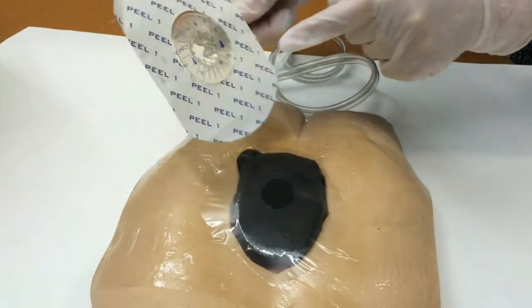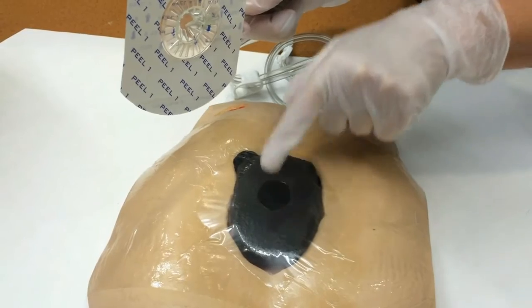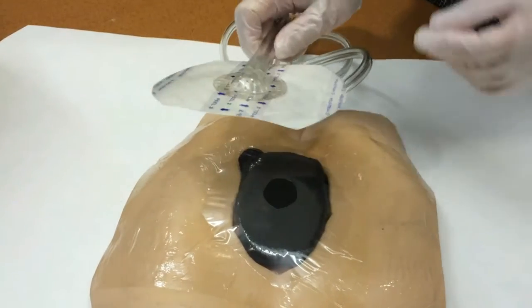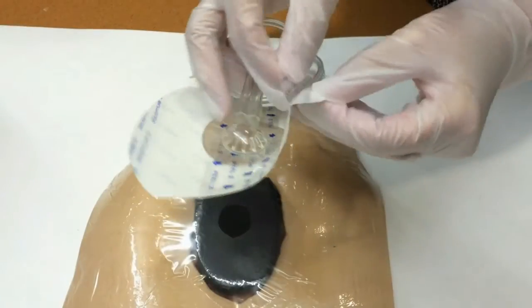What we're going to be doing is we're going to be lining up our dome hole with the hole that we've cut in our transparent drape, and we're going to do that by just easily peeling number one off.